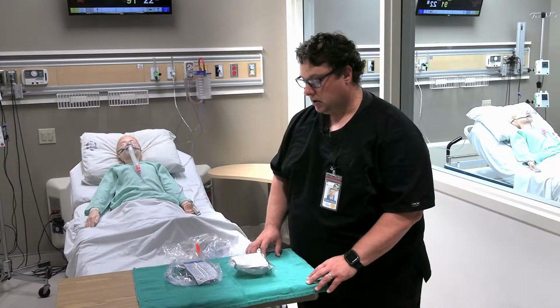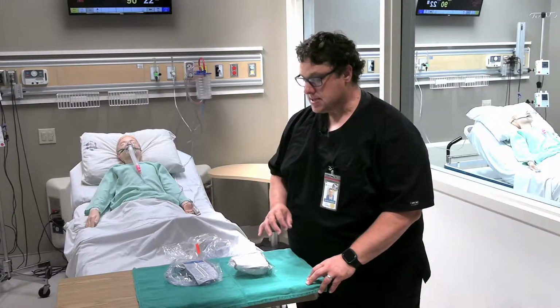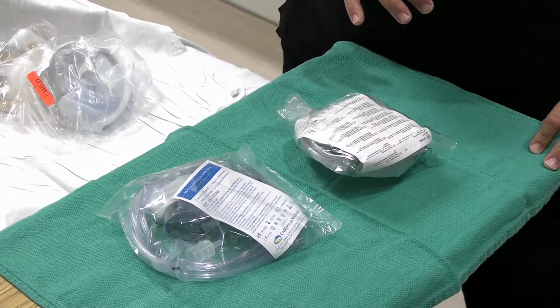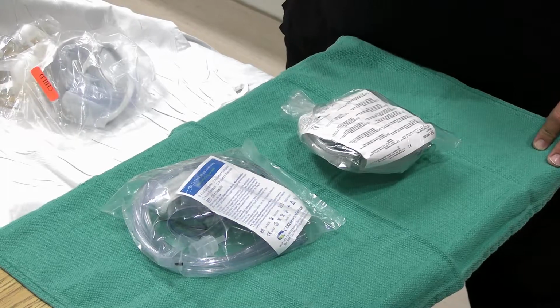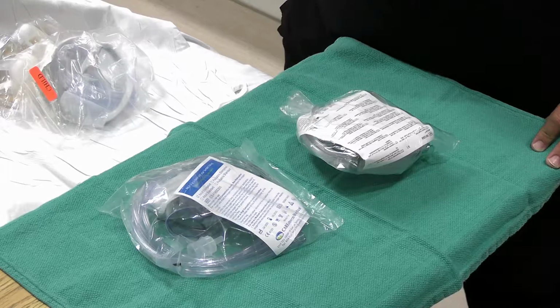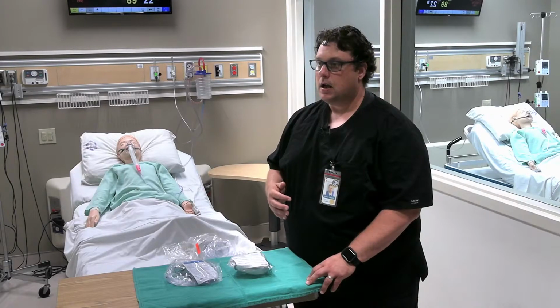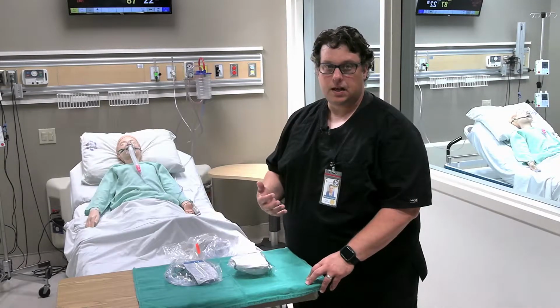So what we have here right now are an adult and a pediatric non-rebreather. The non-rebreather is capable of delivering up to 100% oxygen. So these are typically used for your kids who are in moderate to severe respiratory distress, who are unable to keep their SATs within the target range that you're hoping for. Sometimes a very quick and easy mode of oxygen therapy until you are able to figure out what's going on with your child and to get them stabilized.